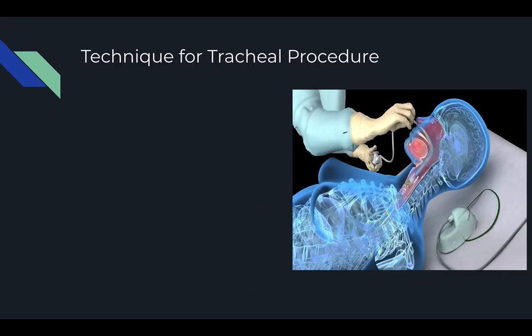For tracheal suctioning, you will want to use a minimal amount of water-soluble lubricant on the tip of the catheter for easier insertion, but not so much as to occlude the catheter. The catheter should be inserted when the patient is inhaling, as this opens up the epiglottis. If able to do so, you should also try to ask the patient not to swallow when the catheter is being inserted, as this can cause the tube to enter the esophagus.